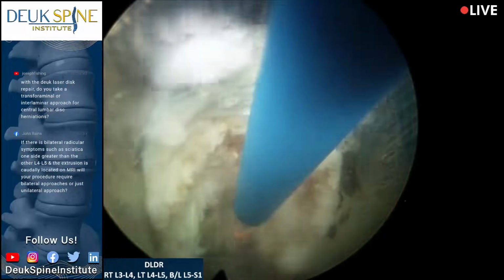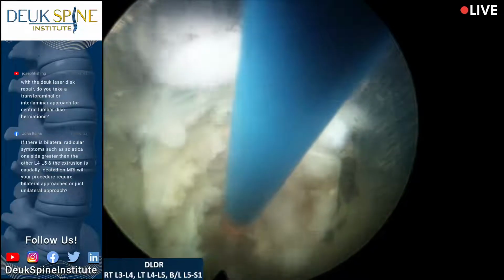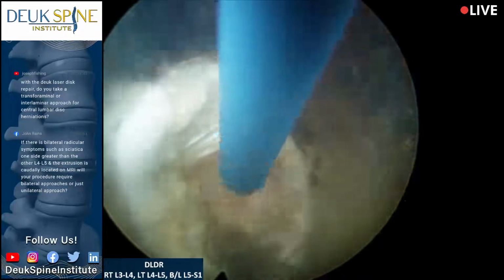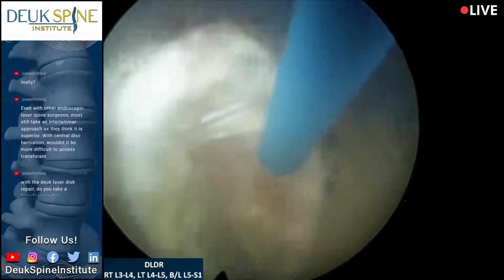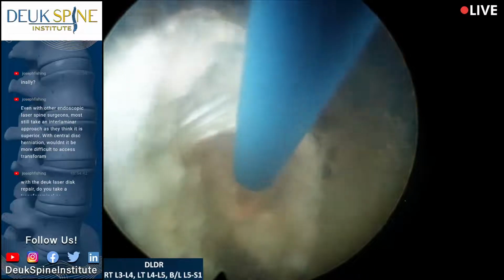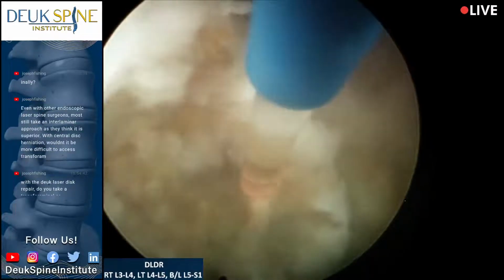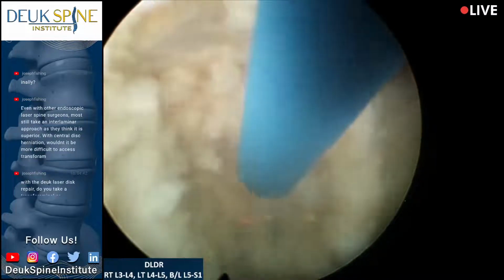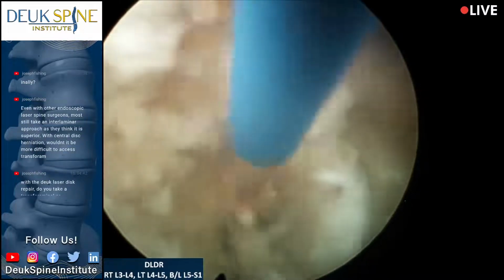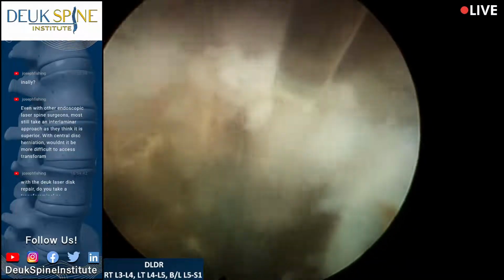Some surgeons that do endoscopic disc surgery in the lumbar spine do an out to in approach, which I don't recommend and I don't perform. I know how to do it, but I don't recommend it. In my opinion, it's a very bad approach. You're right where the nerves are, and you can actually do a lot of damage to people's nerves. It doesn't seem to bother some people, but that's why you do the inside out technique, to be safer.